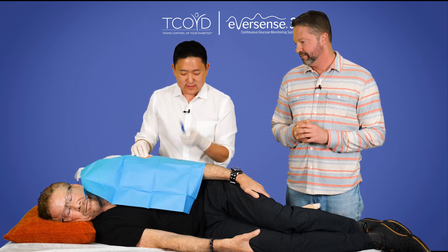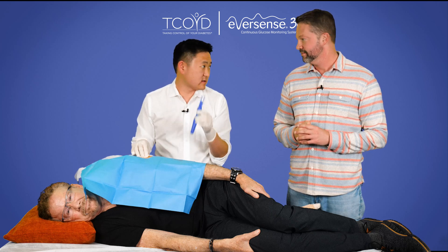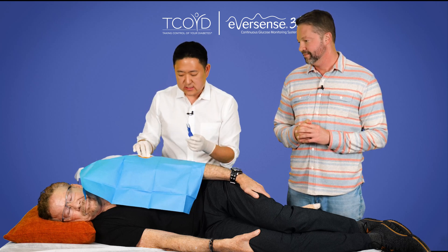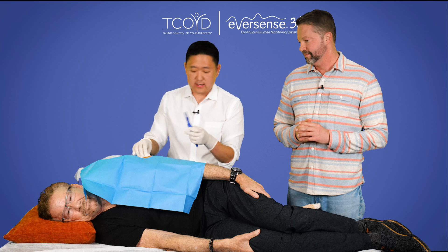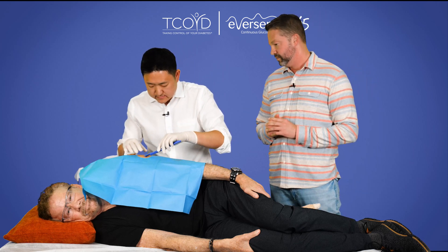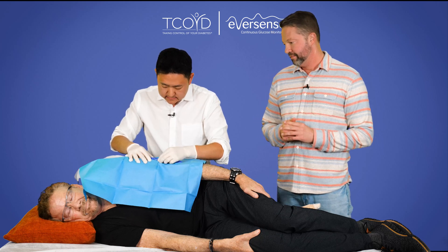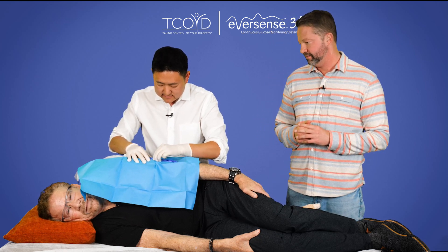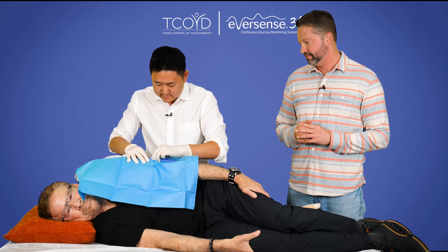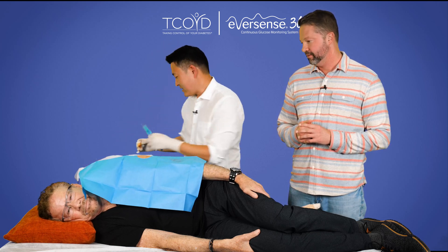What's this fun little thing? So this is the blunt dissector — the fancy name for it — but we like to call it the blue tool. Very simple. And this basically makes a little pocket under the skin where the sensor is going to go. So we're going to just make a small little tunnel right here. How you doing, Steve? I don't feel a thing. Blue tool's in and out. So the pocket is created.